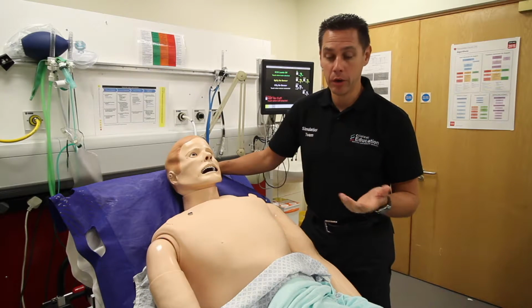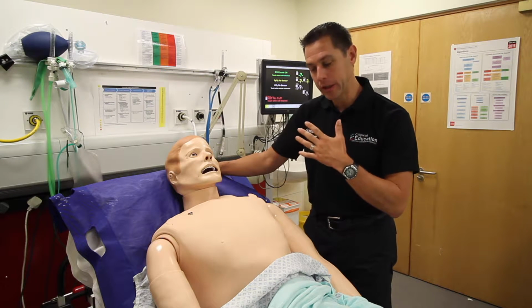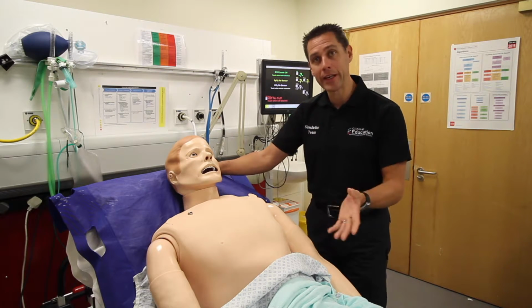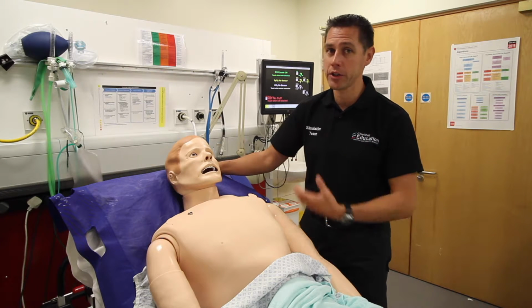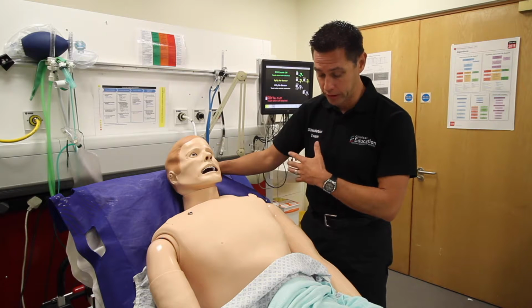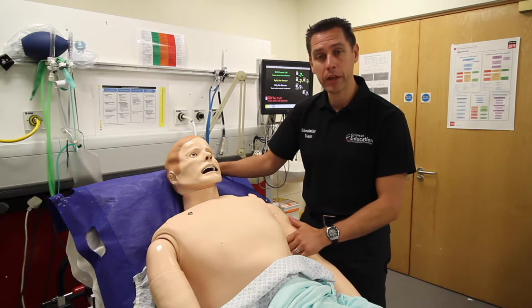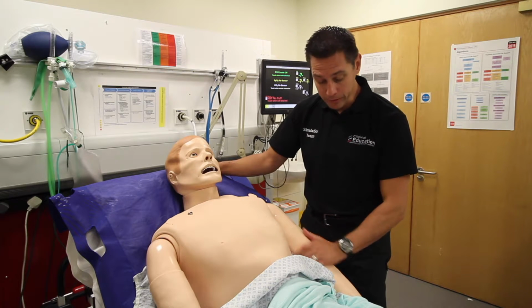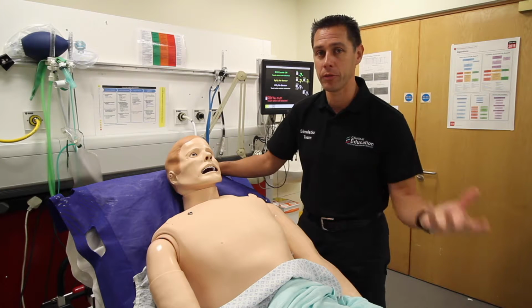So in terms of assessment of the manikin as well, we've talked about pulses, and we're going to look at monitoring. You can put a blood pressure cuff on him, and we can get blood pressure monitoring on here. And depending on the scenario that we're running, we may have an arterial line in there, so you'll have that monitoring on the screen. But as mannequins go, he can sweat, but we don't often make him sweat, but he will always feel like a plastic mannequin.